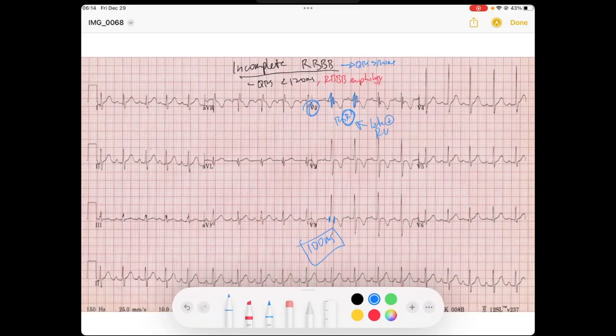If you look in the lateral leads — V5, V6, Lead I — you can see we have somewhat of a slurry S-wave. It's very subtle. That little S-wave is not as sharp, especially in Lead I here. You can see it well: it's a slurred S-wave. It's not as sharp as typical QRS deflections, which usually are very sharp. This is a little slurry.